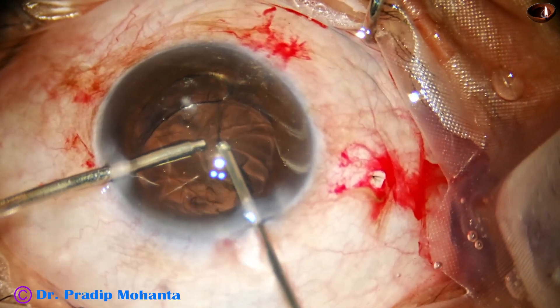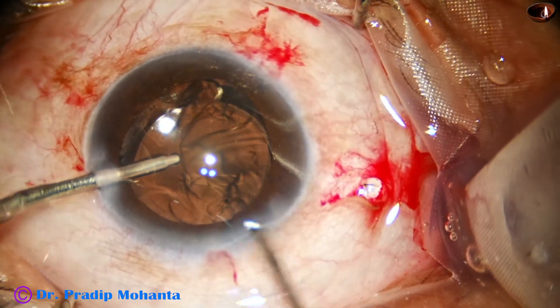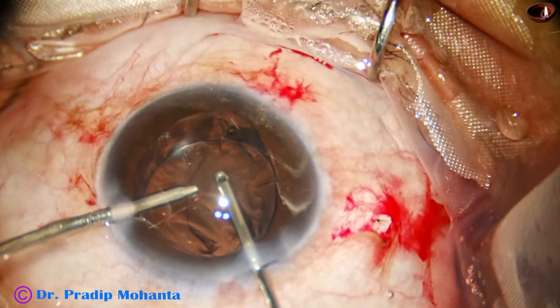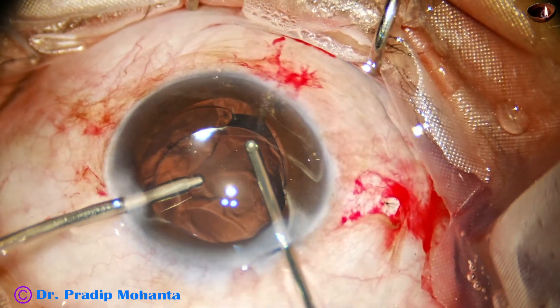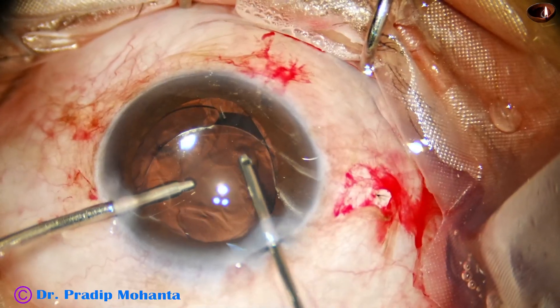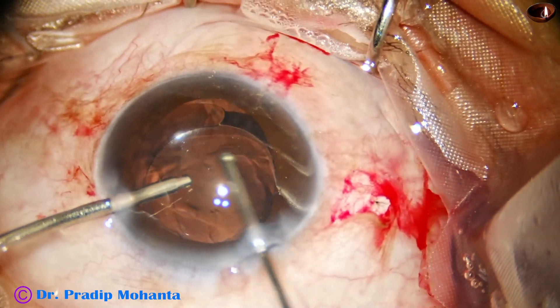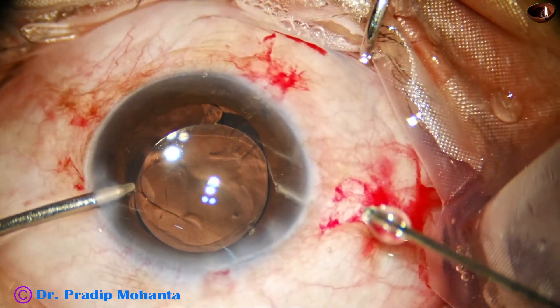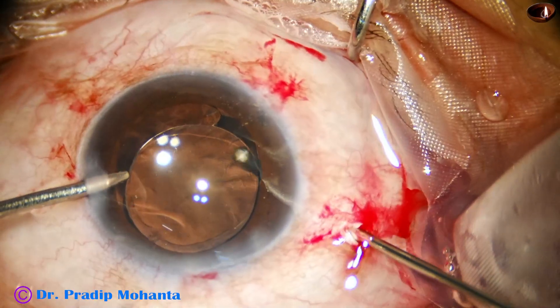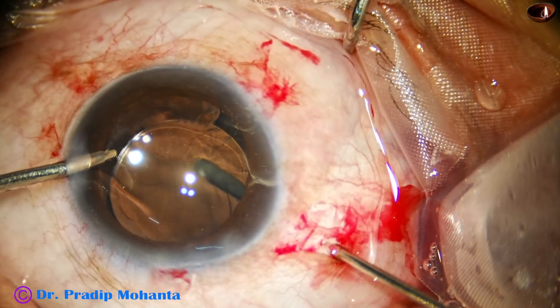The epinucleus piece has been removed. Now I come into the anterior chamber and remove the vitreous strands that were in the dehiscent area. All the vitreous strands came out easily because they had been cut from the other side — from behind. Nicely cleaned. And now I go again into the anterior vitreous and do some additional vitrectomy.